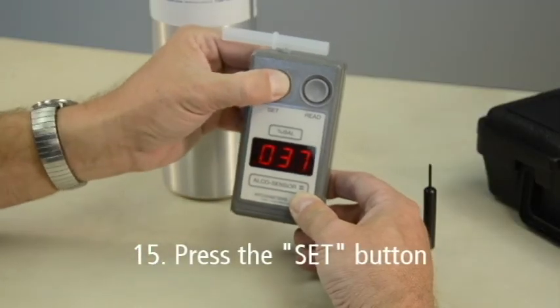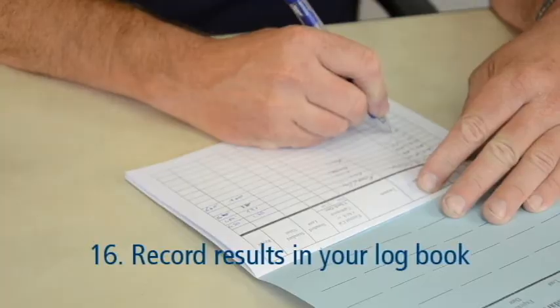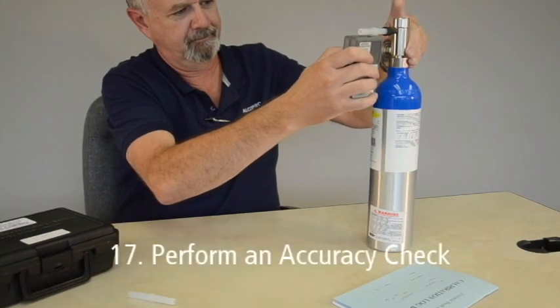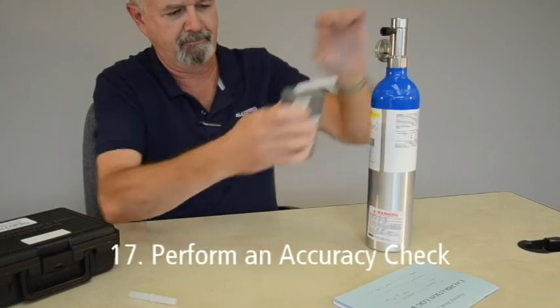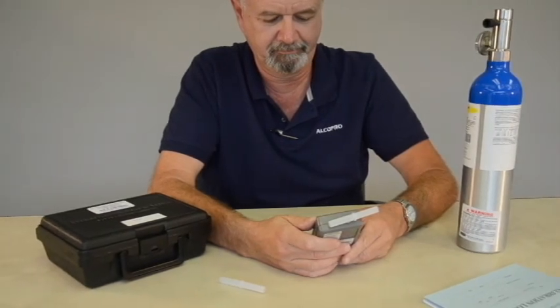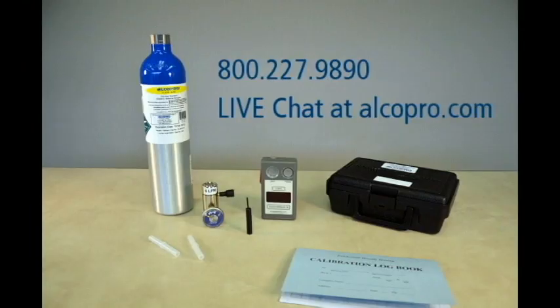Press the Set button. This ensures the fuel cell sampling chamber is in a closed position and the device is ready for the next test. Record the calibration result in your logbook. Finally, perform an accuracy check on your device to verify the calibration adjustment was successful. It is important to note that if your instrument cannot maintain accuracy within an allowable tolerance following a calibration, you must take the instrument out of service and have it evaluated and serviced by a factory trained technician. If you need technical support or repairs on your AlcoSensor breath alcohol instrument, contact one of our factory trained technicians at 1-800-227-9890 or through live chat at alcopro.com.